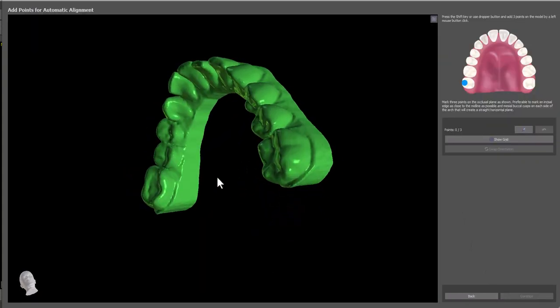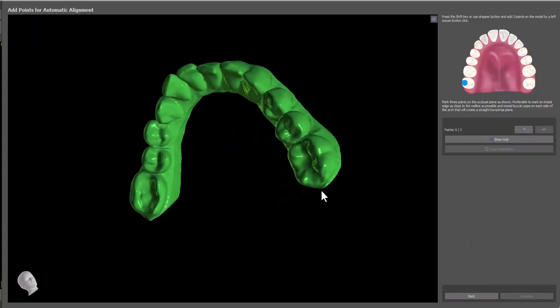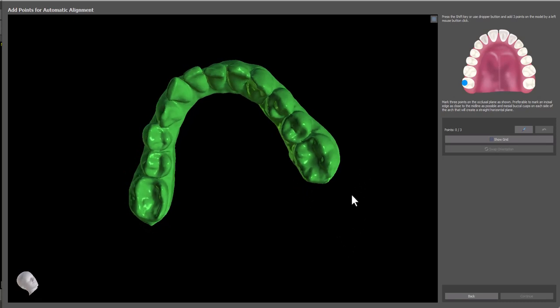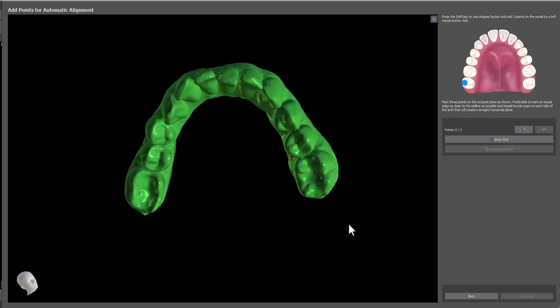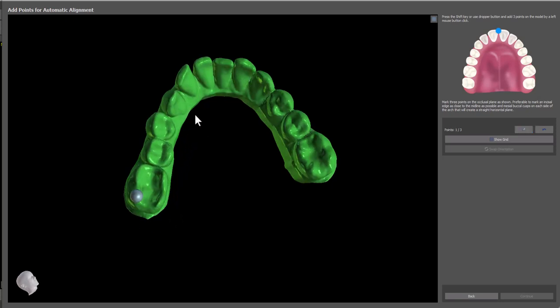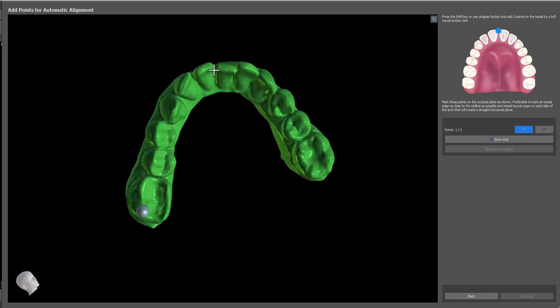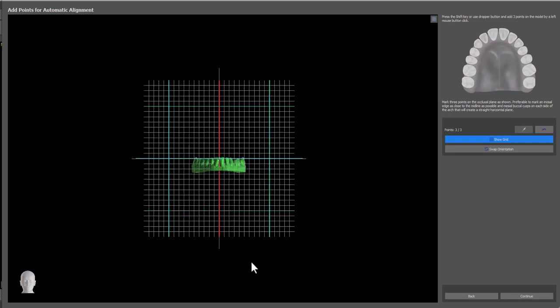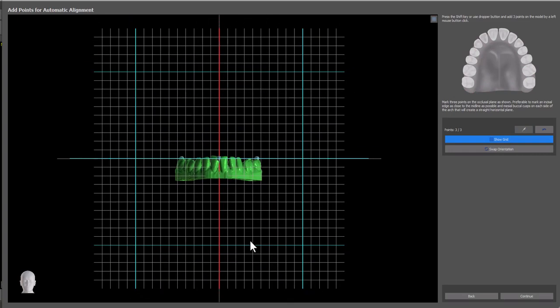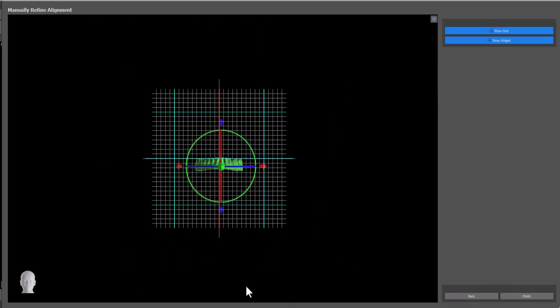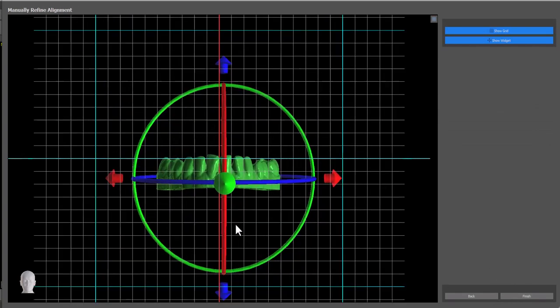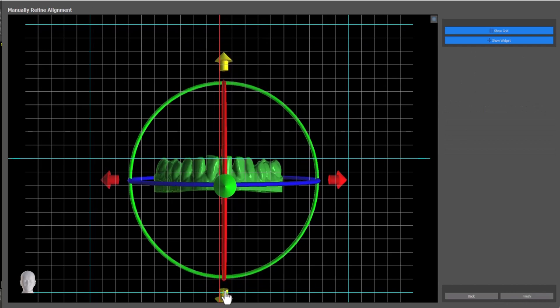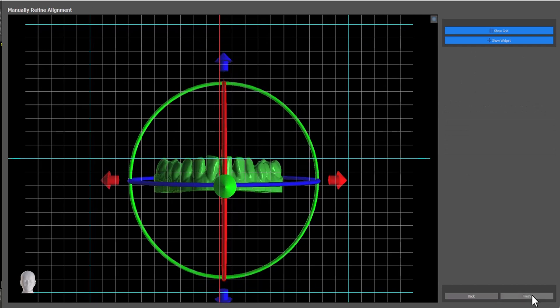I'm rotating the model using the left mouse button by holding down the left mouse button and moving it around. And to mark, I hold down the shift key and left click and I place three dots on a horizontal plane and the model is aligned accordingly. We could click continue and if we want to fine tune any of the alignment or move them all around, we're able to do so and then click finish.